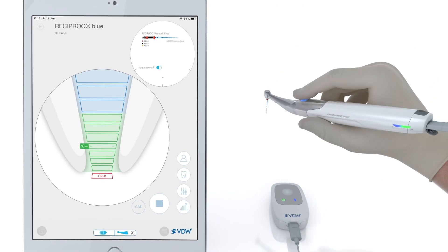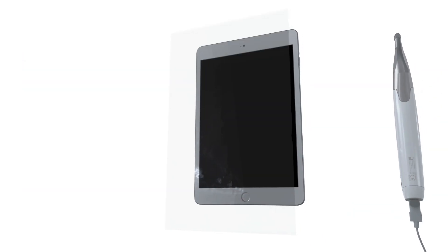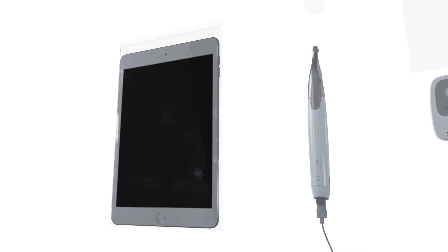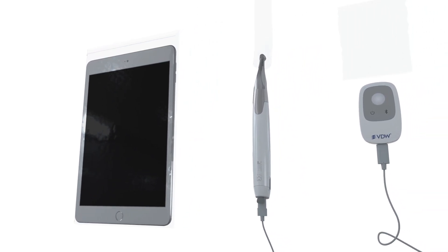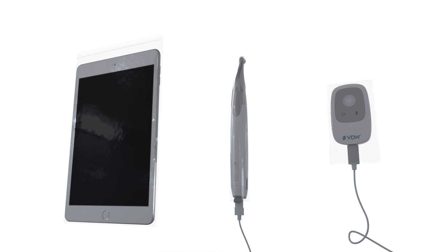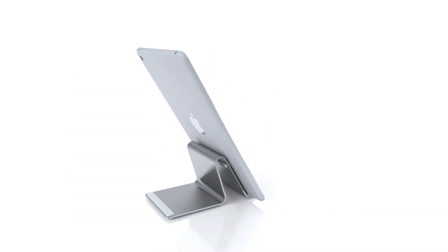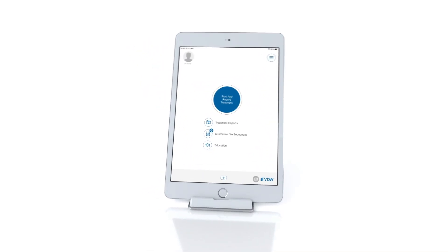You're now ready to perform your endo treatment. Always remember, take the appropriate iPad sleeve that corresponds to the size of your iPad and insert the iPad into the sleeve. Take the VDW Connect Drive handpiece sleeve and insert your VDW Connect Drive into the barrier sleeve. Also, use the corresponding barrier sleeve for VDW Connect Locate. Place your iPad in portrait mode on the iPad stand. The Connect app is only available in this mode.